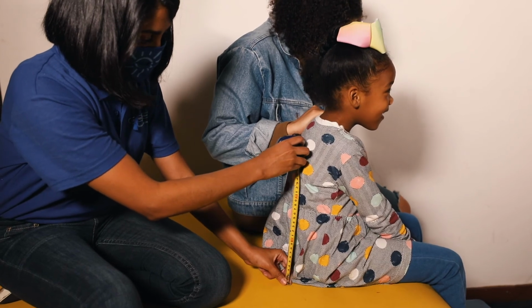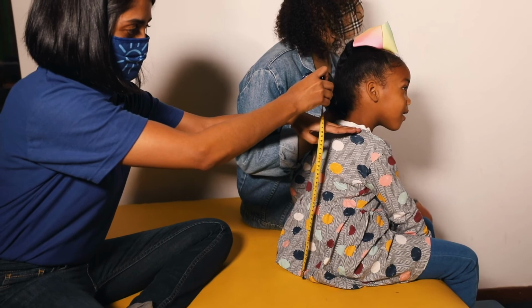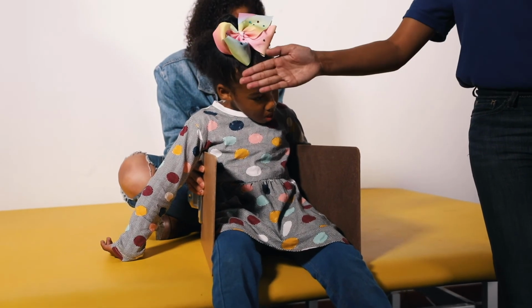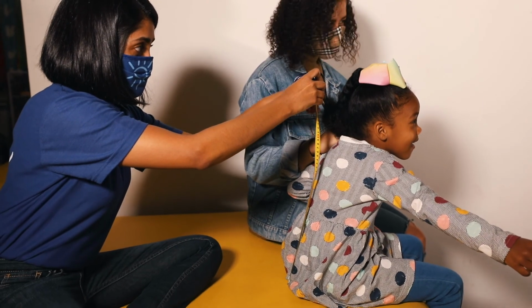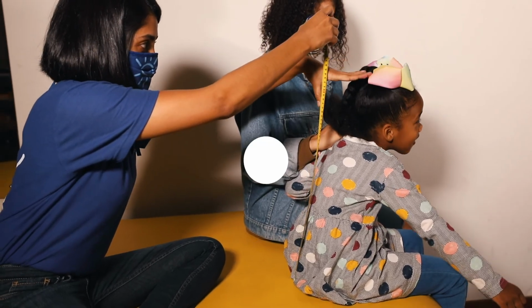Practitioner measures from the seat to the apex of the scapula. Practitioner measures from the seat to the top of the shoulder. The practitioner can use clipboards or books as a guide. Practitioner measures from the seat to the occipital area of the head. Practitioner measures from the seat to the top of the head.